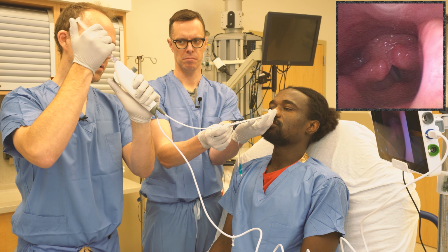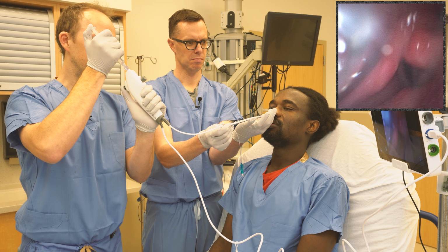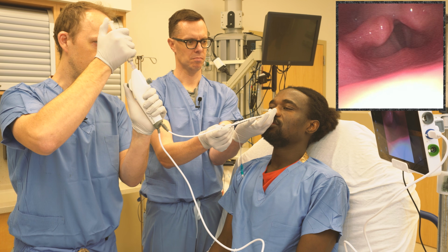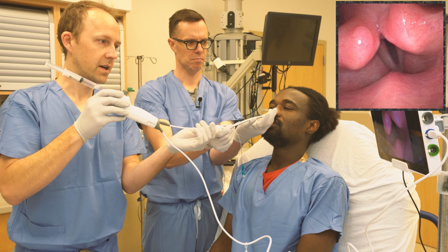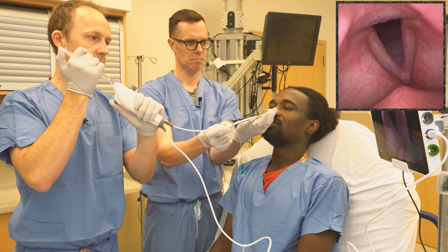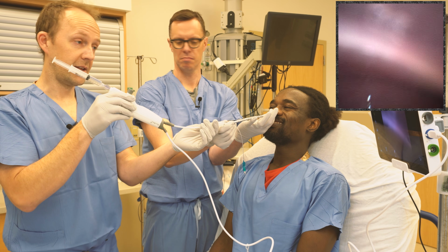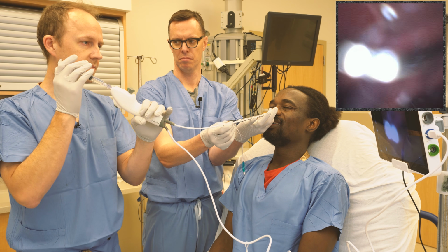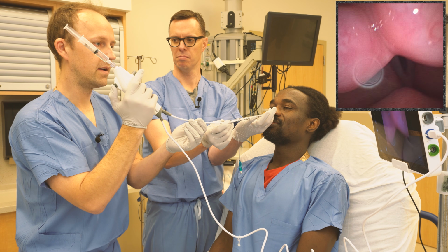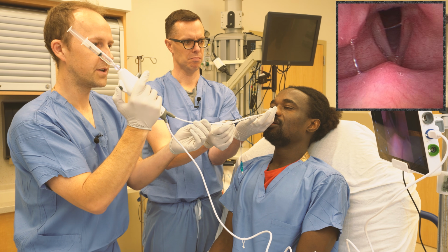Sometimes they're already going to be reasonably numb. And we're going to put just some that we can see hitting the vocal cords. So I'm going to get even just a little bit closer because it helps to have a little bit in the trachea. And again, that really helps pass the tube, really helps pass the scope. We want it to be very comfortable for the patient. And it does help to have them inhale as well while you're squirting the lidocaine so that they can get as much into the trachea as possible here.